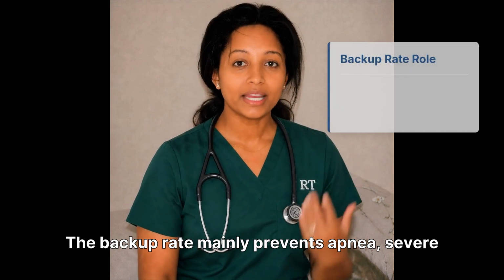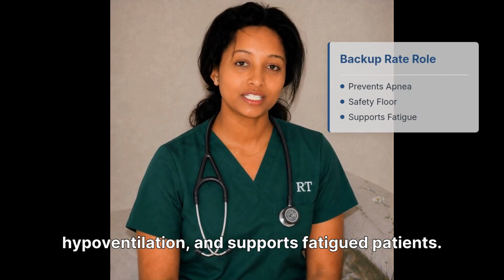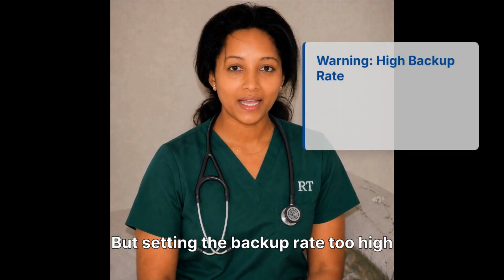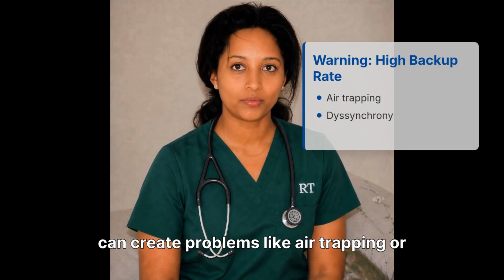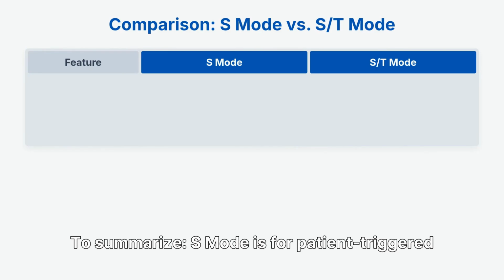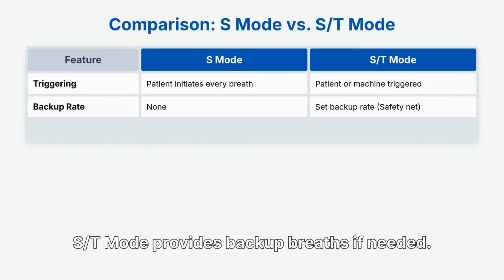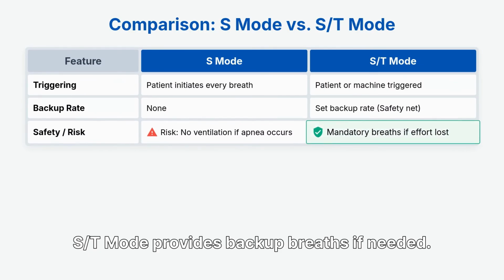The backup rate mainly prevents apnea, severe hypoventilation, and supports fatigued patients. But setting the backup rate too high can create problems like air trapping or poor patient comfort. To summarize, S mode is for patient-triggered breaths only. S/T mode provides backup breaths if needed.